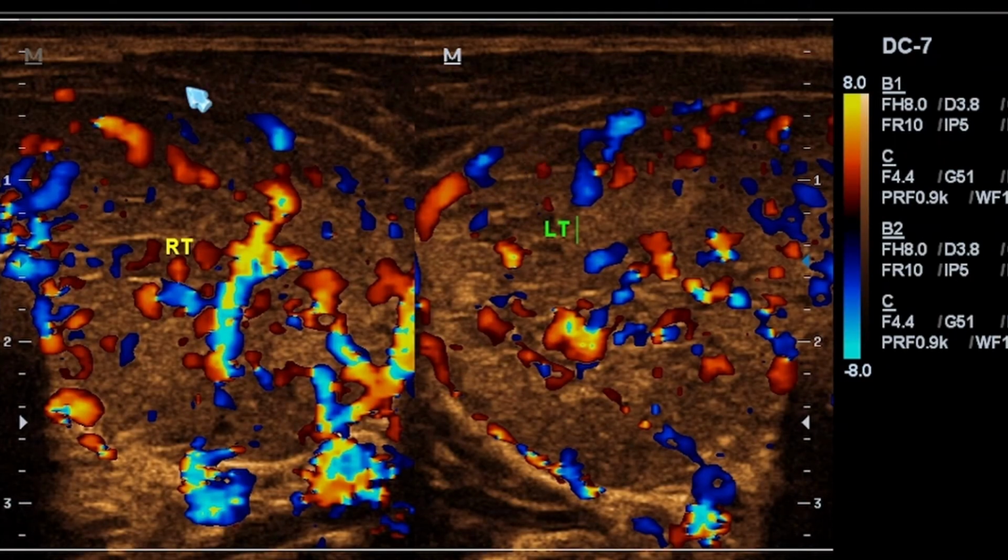This is what must be done routinely when you're doing an ultrasound scan of a duplicated organ: you have to compare the two lobes, or the two sides. So this is our left lobe, and this is our right lobe. As you can see, there is a homogeneous, uniform Thyroid Inferno in both lobes. What we are seeing here is a Thyroid Inferno that is extensive and affecting both lobes. So you can see that this is diffuse Hashimoto's thyroiditis.